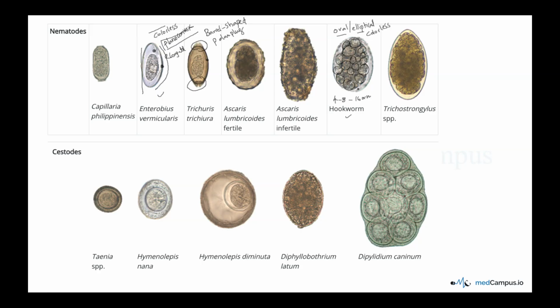Okay, so if someone asks you, I have come across a question wherein they have given a presentation of a child with anemia, because hookworm infection is an intestinal infection leading to anemia, and in the feces they have shown this egg. In the options they have given the first option as Ancylostoma duodenale, the second option as Necator, and the third option as hookworm. The fourth is, let's say, roundworm or Ascaris, which is ruled out, right? So now we are confused with these three options. So what is the concept here?